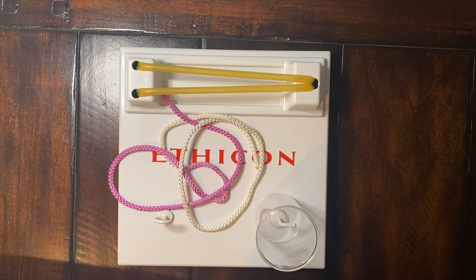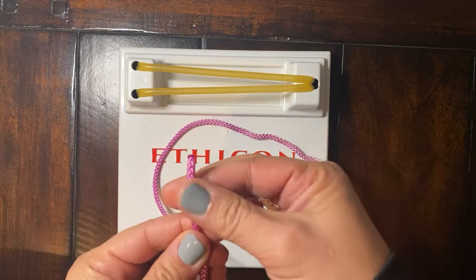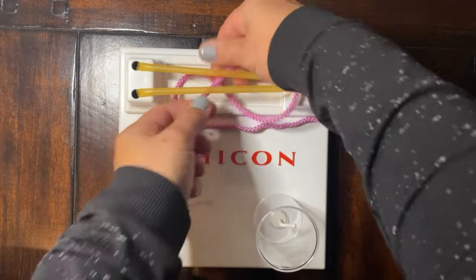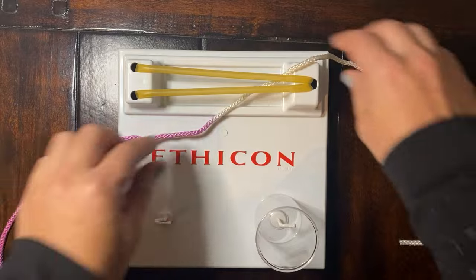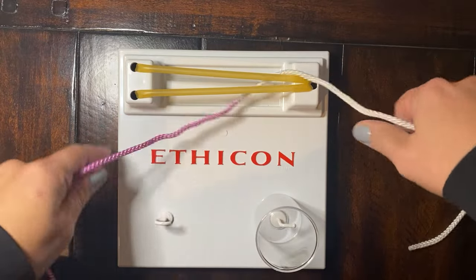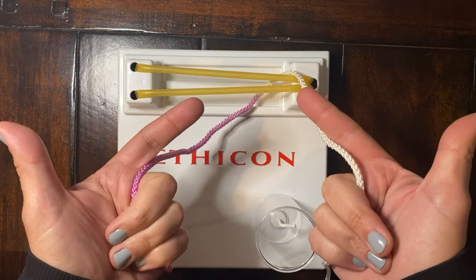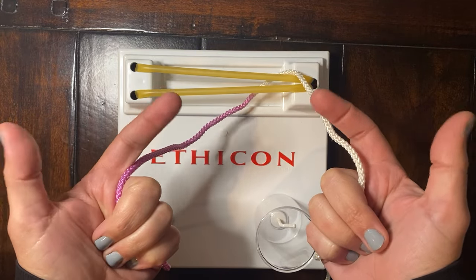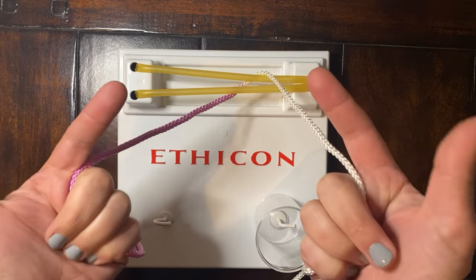Today we'll talk about two-handed knot tying techniques. When we start and throw our suture, we'll act like the purple end has a needle and the white end does not. When we start our two-handed knot tying technique, we begin with what I call a pistol grip — the lower three fingers will be holding the suture, top two fingers will be free.